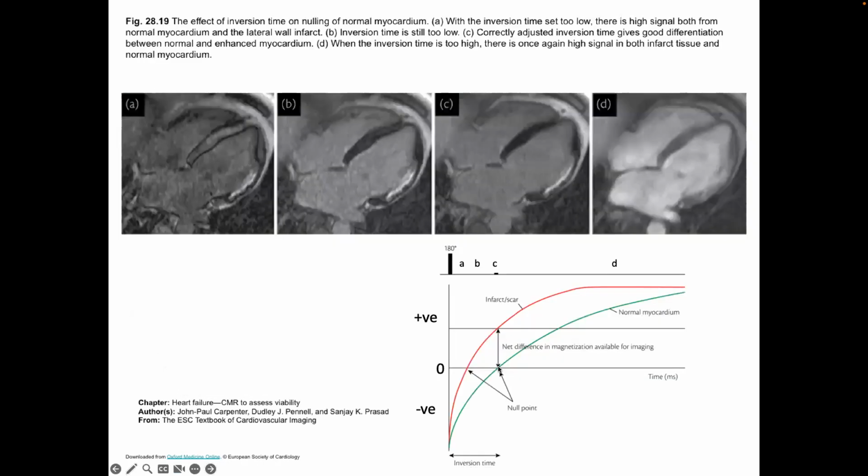For some reason, a lot of manufacturers don't want to make phase sensitive images. So that means they don't want to have to make negative pixel values. And the reason is a lot of things in MR change this global phase. And so when you try and make a picture that has both positive and negative pixel values, those positive and negative values can get affected by other things like magnetic field inhomogeneity, motion, stuff like that. And so it complicates the reconstruction.